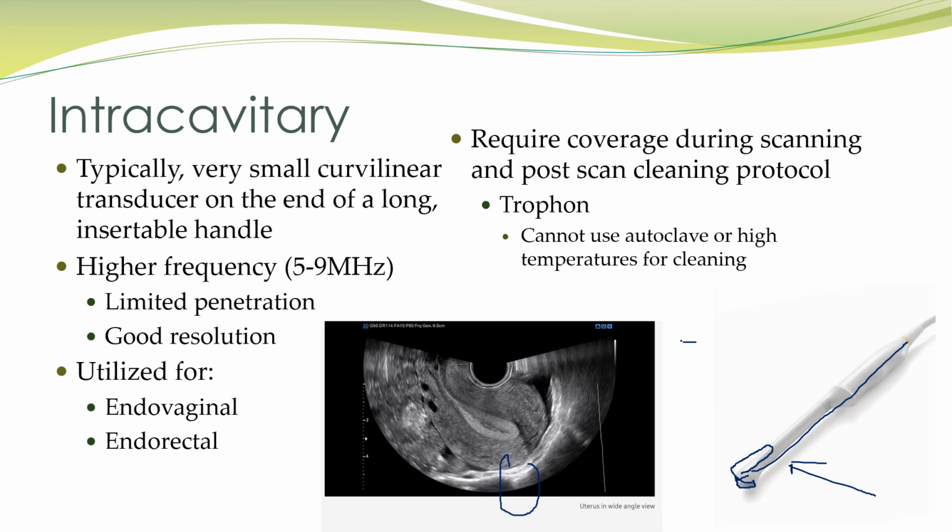Now, obviously covering of these, usually we recommend adding gel to the tip as a coupling layer, covering it with a non-latex probe cover or condom, and then covering it with KY jelly on the outside. That will allow good transmission of sound through those multiple different layers while protecting it from a lot of pathogens.